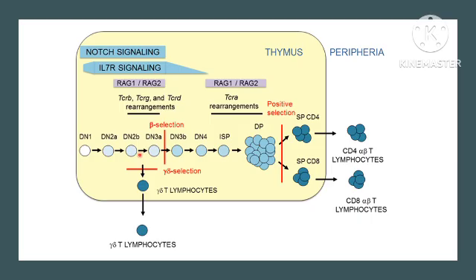That can only be confirmed by doing the TCR beta assay. If the TCR beta assay is positive, that means the cell has both gamma and beta signatures, but the assigned lineage will be beta. If TCR gamma is positive and beta is negative, that means the cells belong to the gamma delta subset, because gamma delta T lymphocytes never reached the point of attaining beta rearrangement.